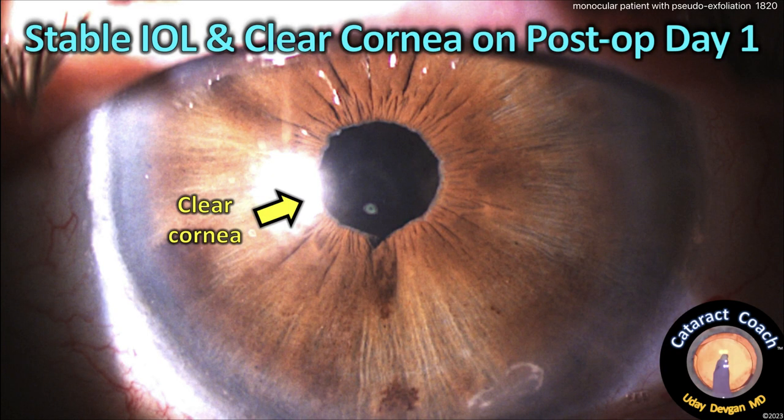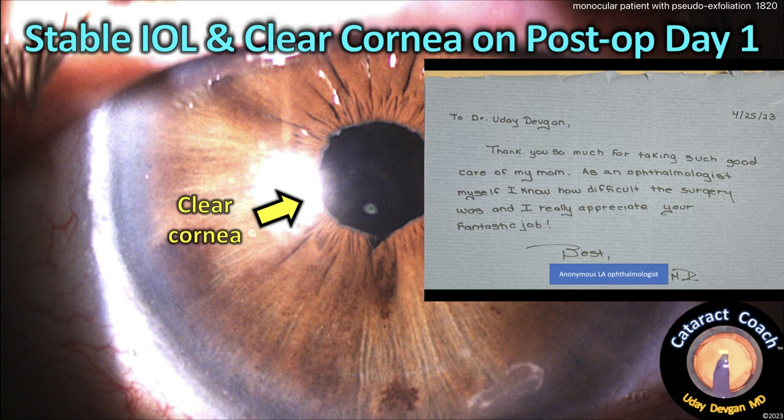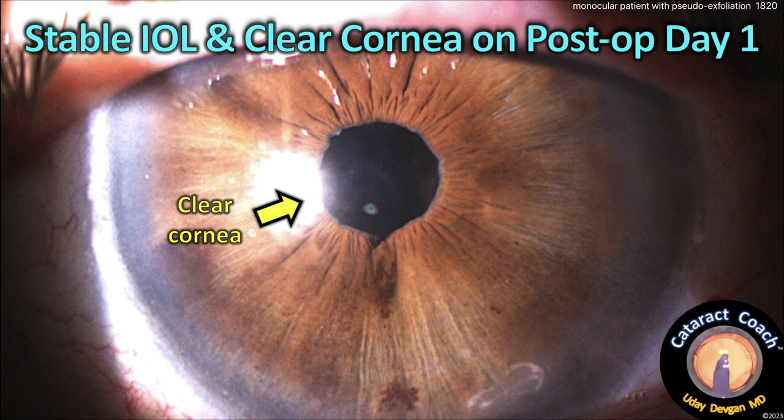Here's post-op day one — look at that totally clear cornea. Yes, this is a post-op day one picture. The patient was so thrilled; the patient's daughter, an ophthalmologist herself, sent a sweet thank-you: 'Thank you so much for taking good care of my mom. As an ophthalmologist myself I know the difficulty of the surgery and I really appreciate your fantastic job.' Such a pleasure to operate on fellow ophthalmologists and their family members. The final result of about minus one gives good all-around vision. You can see a little bit of triamcinolone particles at the inferior paracentesis, but otherwise it's all pretty much gone. Patient had a beautiful outcome.